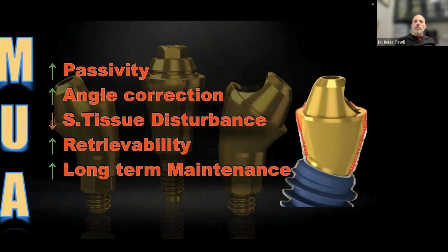It doesn't disturb the soft tissue because I'm not taking the abutments in and out, so I'm not disrupting the area around the implant connection. It makes it easy to retrieve because I can just remove the Teflon tape that's blocking it, unscrew everything, and clean it if I find that there's some gingival irritation. And that helps me for my long-term maintenance. If I need to remove it and add some material because I have a little shrinkage, I can do that with simplicity, as opposed to going direct to the fixture and stressing that connection over and over and over again. I can change these screws.